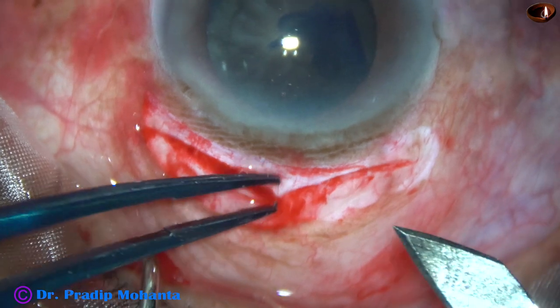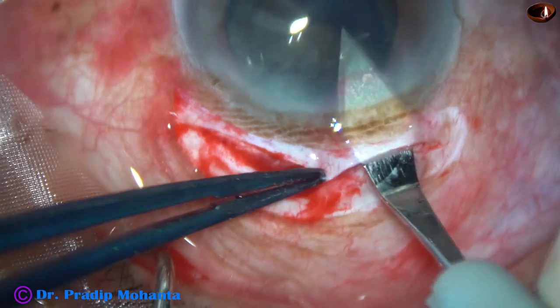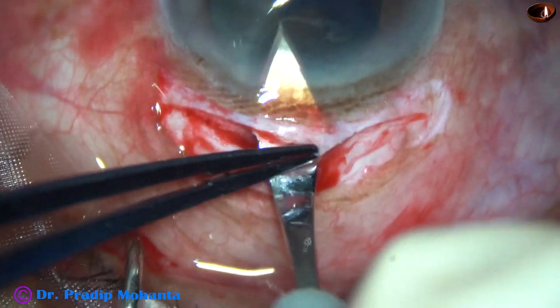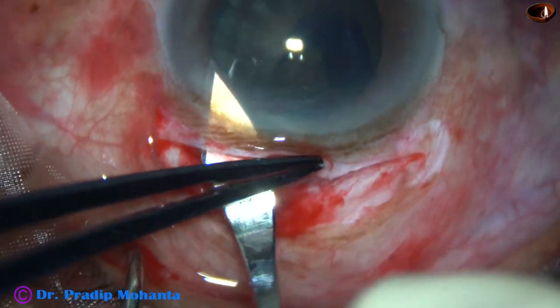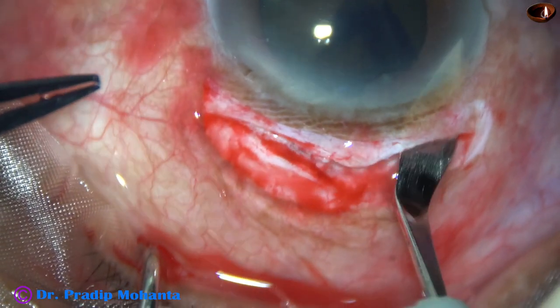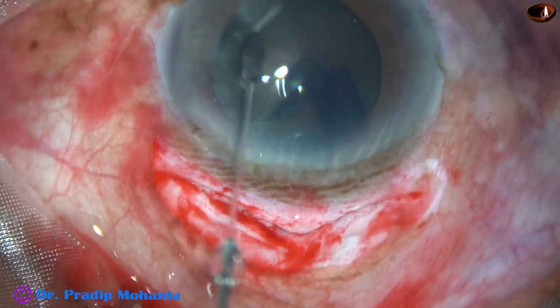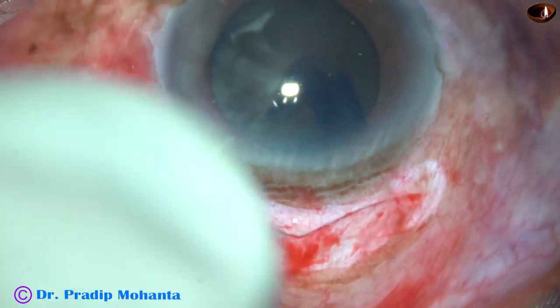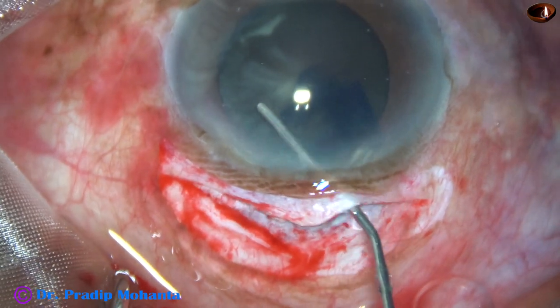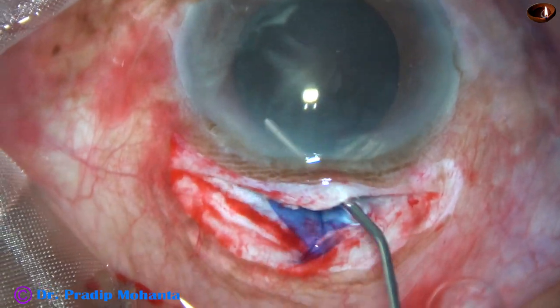And now the tunnel is opened. Go to the anterior extreme and then cut the tissue as you go forward with the keratome. This is a large wound of about 10.5 millimeters, but because of this kind of incision we will need only one suture at the apex of this V-shaped incision.